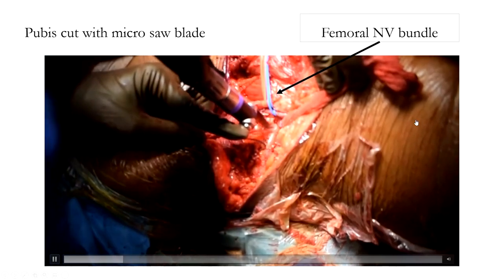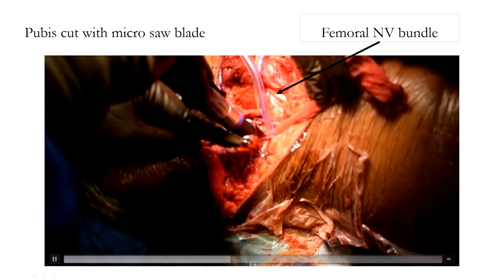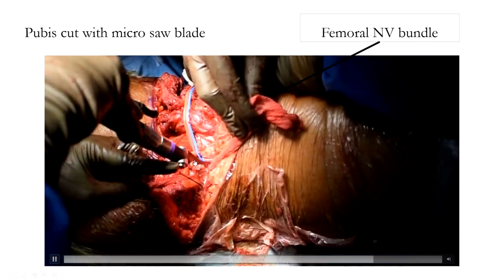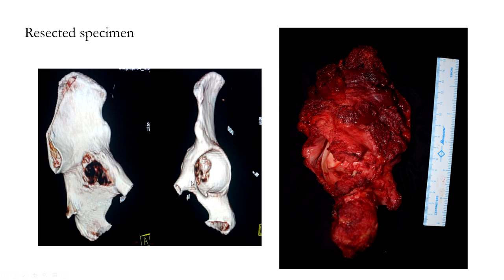Once the posterior iliac cut was complete, the superior pubic ramus was cut anteriorly using a micro saw after isolating and protecting the femoral neurovascular bundle. The ischial cut was then performed to resect the tumour mass in toto. Special consideration was taken while resecting the sacrospinous ligament.